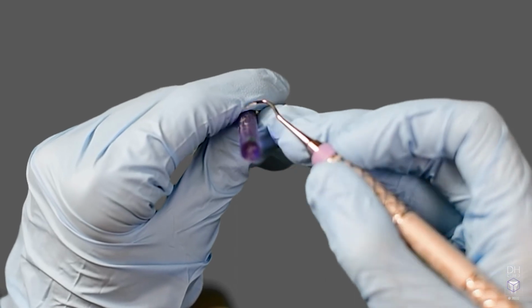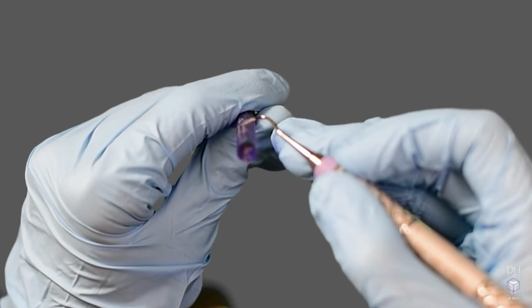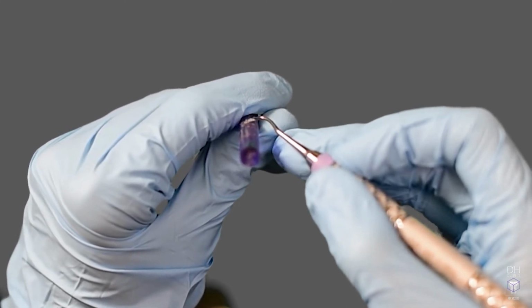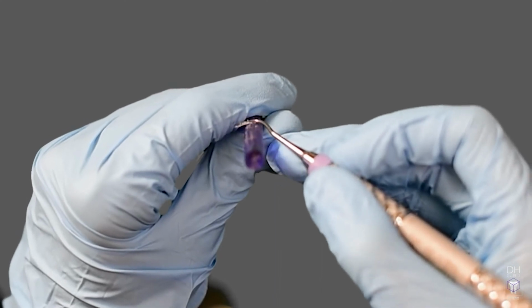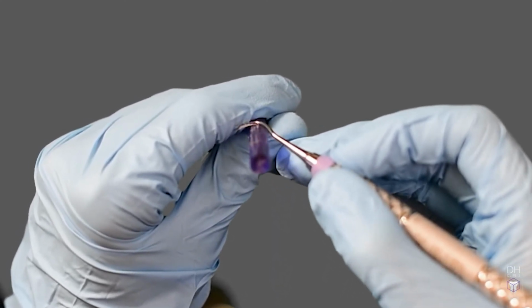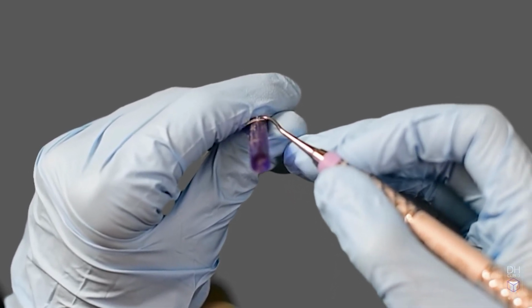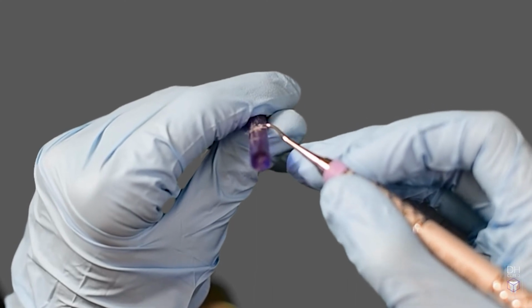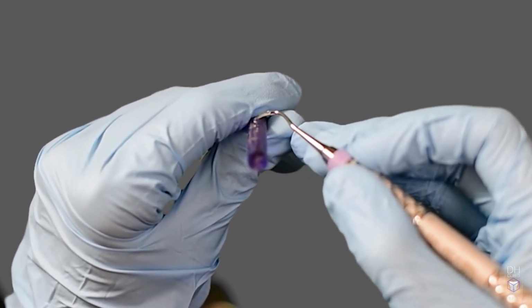When at chairside, you can also check for sharpness by using the disposable hard plastic air-water syringe tip. Be sure to check the entire cutting edge from shank to tip. Looking closely, you can see the terminal shank end of the instrument is not shaving and is therefore not sharp. But at the middle section, it is shaving really well with little pressure. And at the tip end, it is shaving but can be sharper.